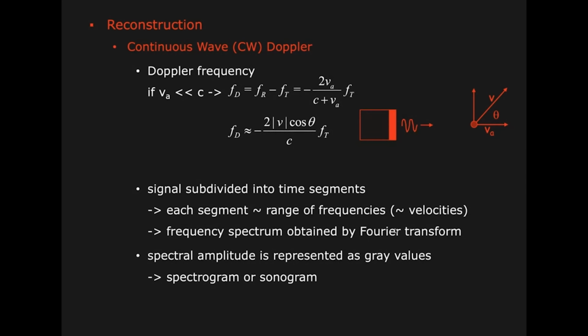But keep in mind, when we remember Fourier theory, it says that a sine wave in the spatial domain is one frequency in the frequency domain. And it's this one frequency that we need. But in order to create one frequency in the frequency domain, we need a full continuous sine wave. So that means it needs to be a sine wave of infinite duration.